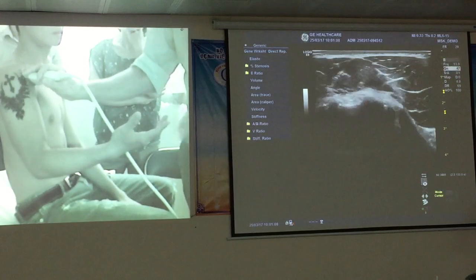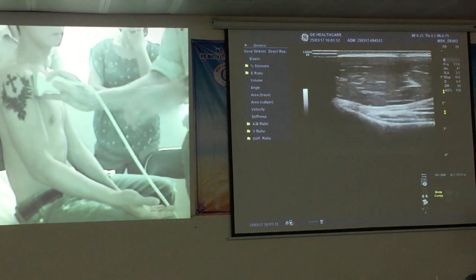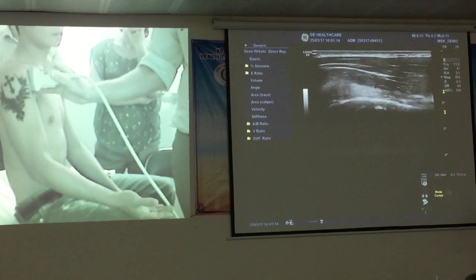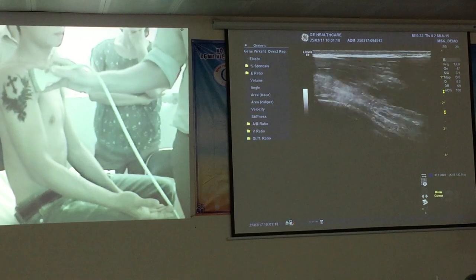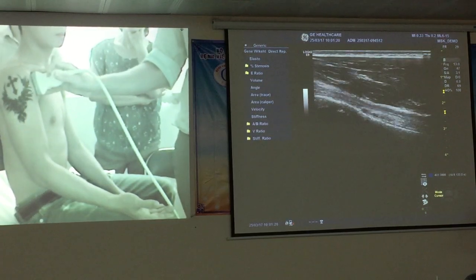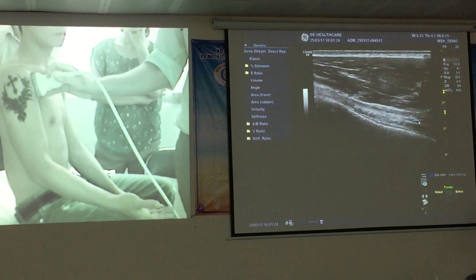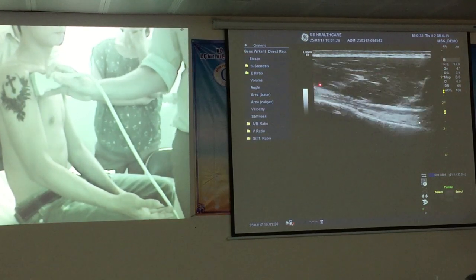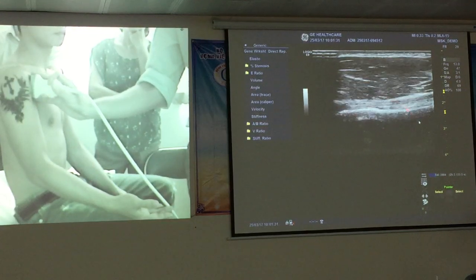Okay, so from there I would have a look at the tendon in longitudinal plane. Mình xoay đầu dài cắt dọc để khảo sát trục dọc của gân nhị đầu. So to get this image, if you just put the probe straight on the skin, you can see that the tendon dives deeply. Mình xoay đầu dài cắt dọc thì mình sẽ thấy là cái hướng đi từ phía đầu về phía chân thì cái gân cơ nhị đầu này sẽ đi từ nông về sâu hơn.